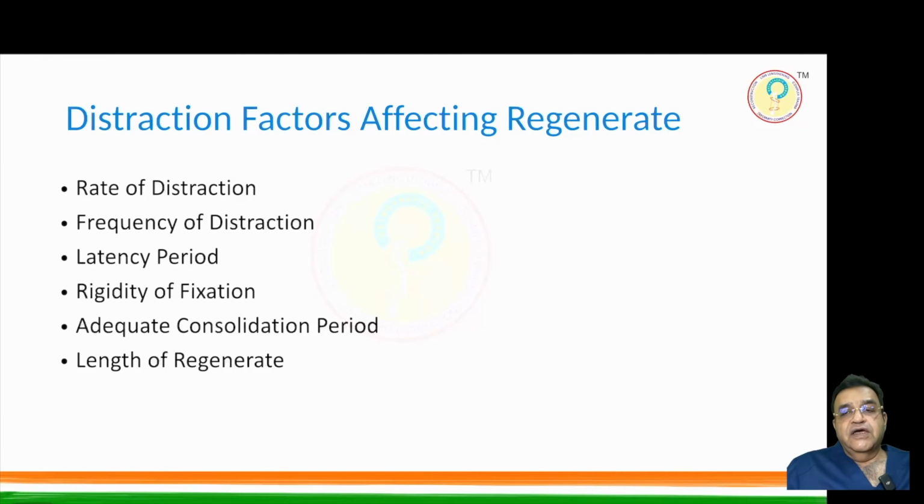If your fixation is not rigid, like your frame is not rigid, then there is a problem with the regenerate, and you have to give adequate consolidation time before you remove your frame, and it is very important. So it is important to do the stress test before you remove the frame. And length of the regenerate: if it is a very long regenerate, then you have to give more time for consolidation. So these are the factors where you have to be very careful, formation of regenerate and when do you remove the frame.